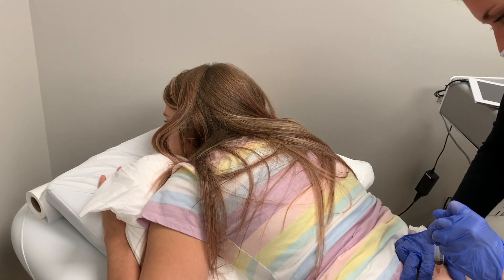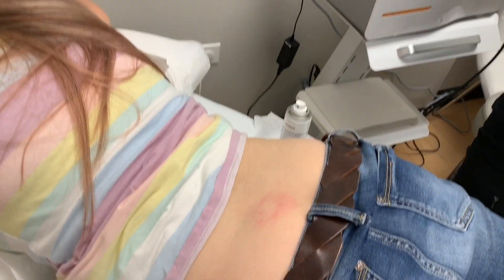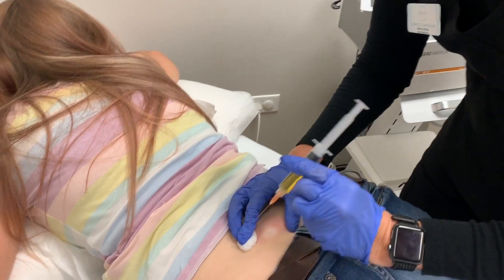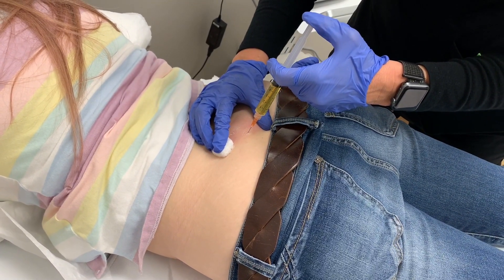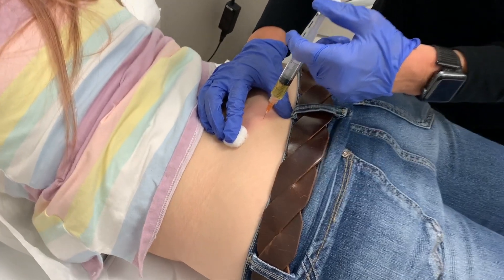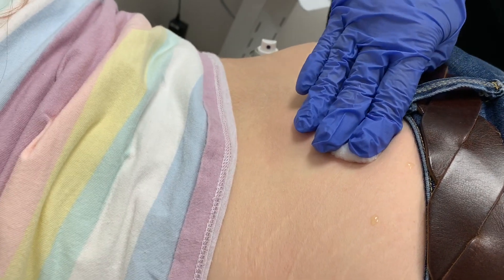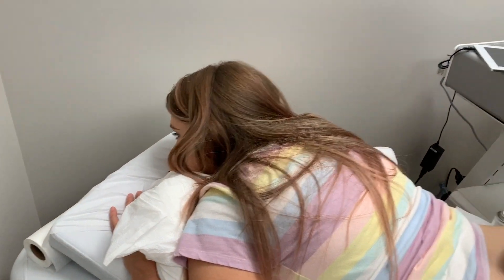You got two done. You're so tiny that it's definitely going to be a lot of fluid for that area. How are you feeling? Good. This will absorb. She's puffing up. Three done. Still hasn't fainted.